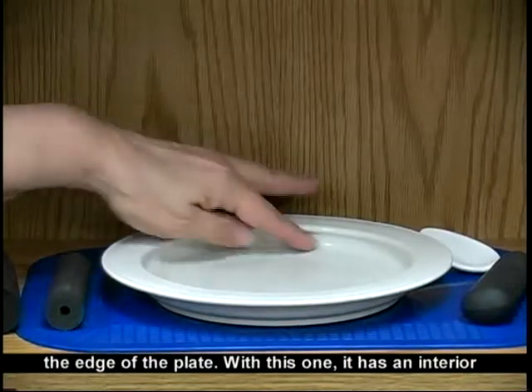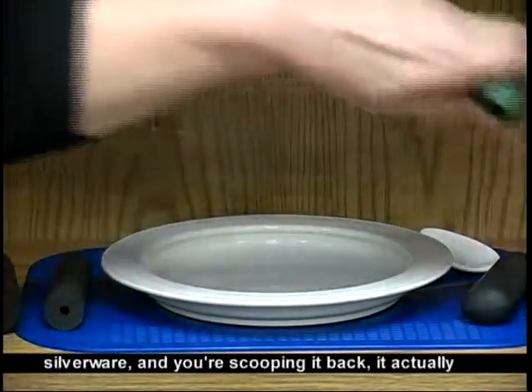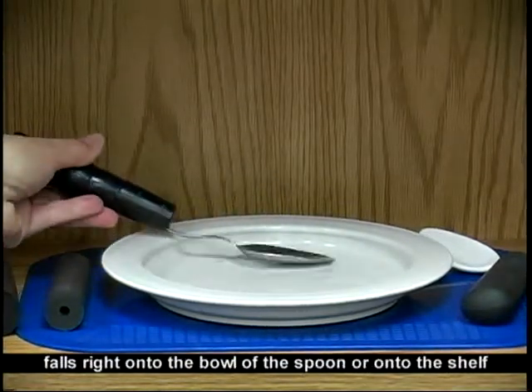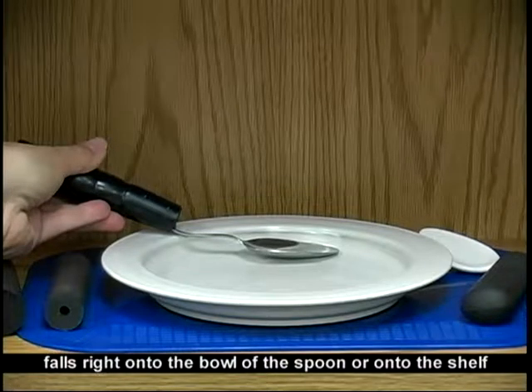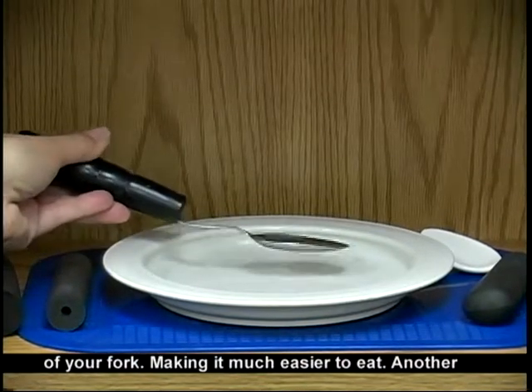With this one, it has an interior ridge on the inside, which means that when you're using silverware and you're scooping it back, it actually falls right onto the bowl of the spoon or onto the shelf of your fork, making it much easier to eat.